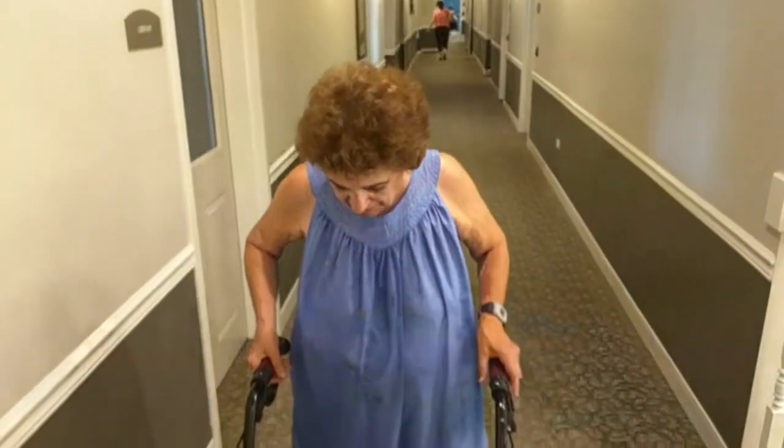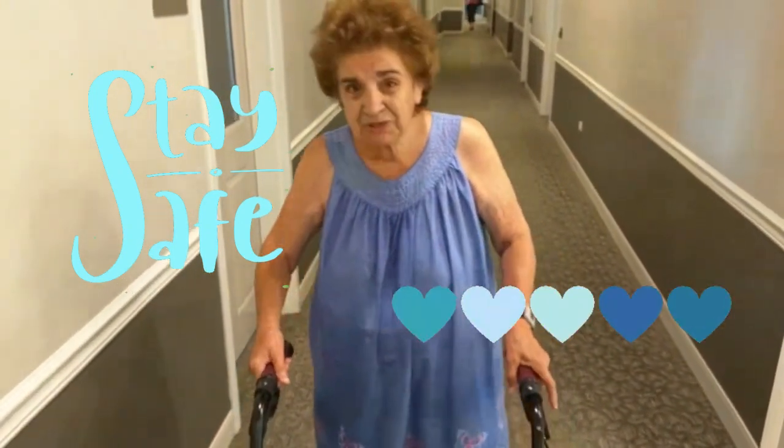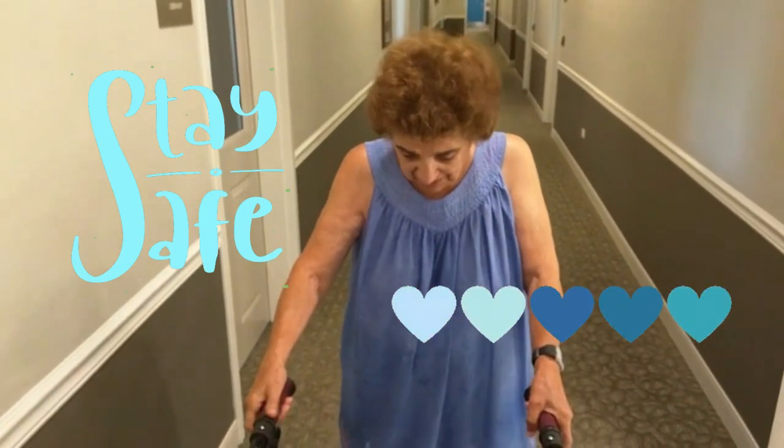I like it very much because it feels strong and it's a pretty color, and it can get around much better than the other one. It has storage for groceries and everything else. Very nice.